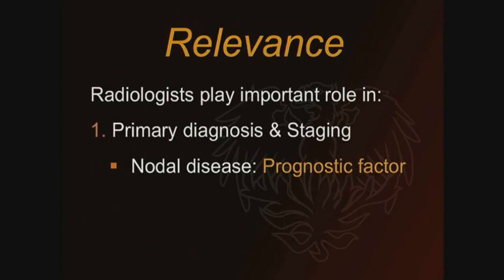Regardless of the type of practice that you have, I'm sure that we all run into oncologic patients every day. And of course, diagnostic imaging has a really important role in the staging of these patients. Not only the diagnosis, but during that diagnosis, the primary staging is pretty much what's going to define the prognosis for these patients. And imaging has an essential role in nodal staging. These are usually lymph nodes that are not evident on physical exam. And by different imaging methods, we can actually define what's metastatic at the time of diagnosis.